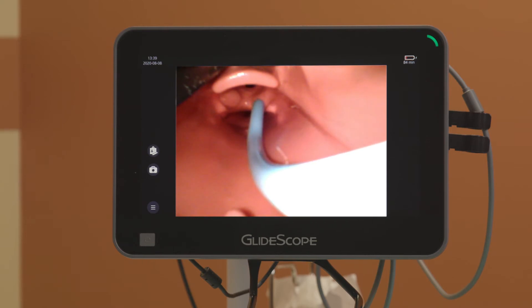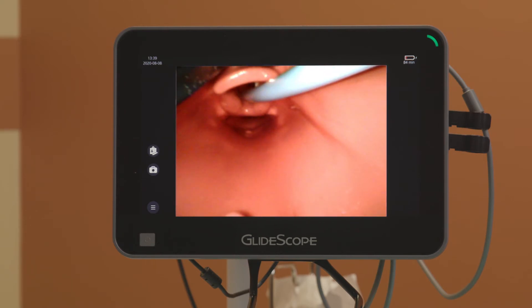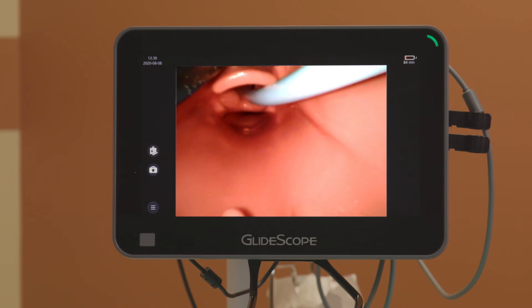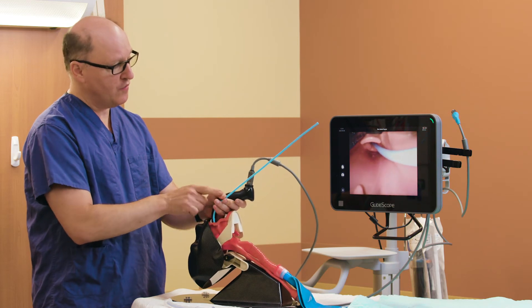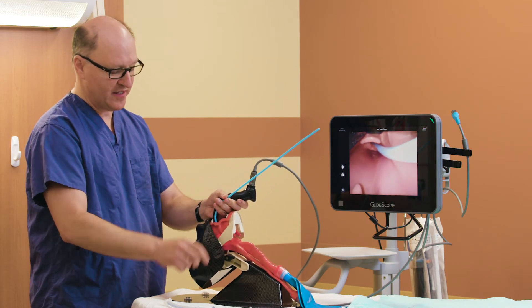I insert into the trachea, coming around the curve, and I'm in the trachea and I can feel the tracheal rings. I can rotate it slightly rightward so it fully inserts. I can then bring the bougie over to my left hand, stabilizing it.